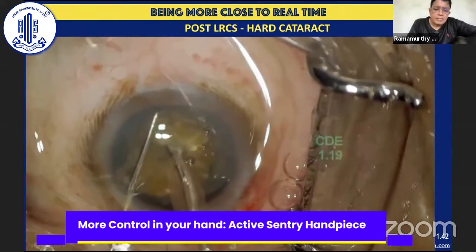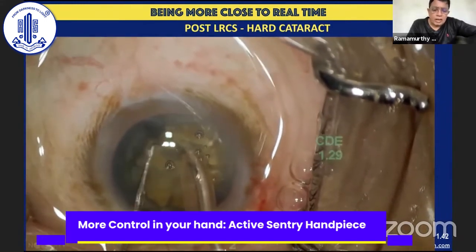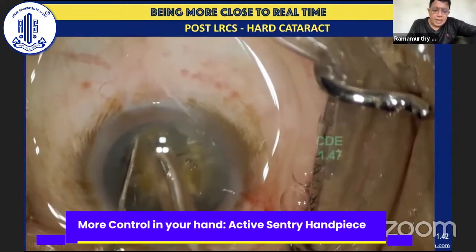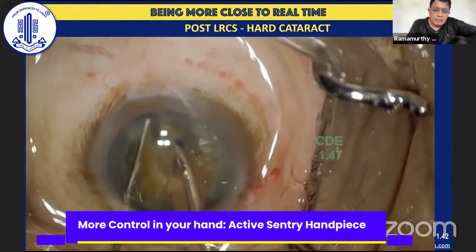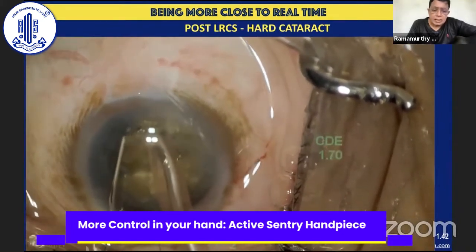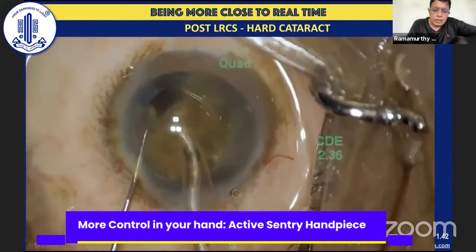As I already mentioned, during this stage, often I'm using only longitudinal phaco, and it's essentially only torsional phaco when I'm evacuating the fragments. As you can see here, all these activities are happening within the capsular bag. And I always make sure that depending upon the density of the cataract, I split the nucleus into 4 to 8 fragments, and the CDE is also quite low.